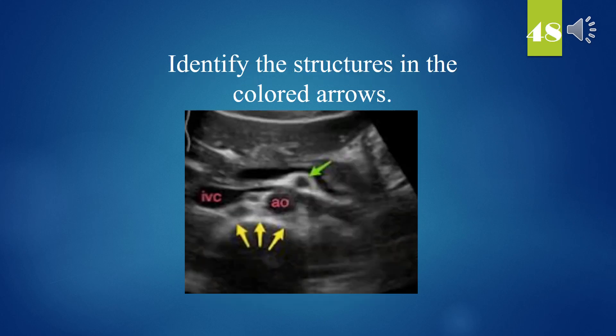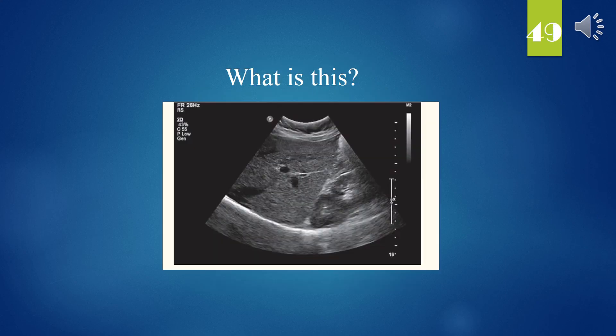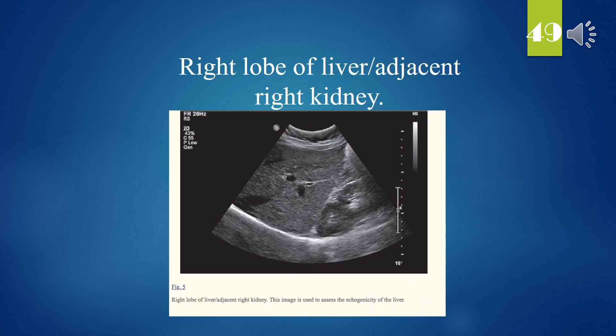Identify the structures in the colored arrows. Green: SMA. Yellow: border of the spine. What is this? Right lobe of liver, adjacent right kidney.